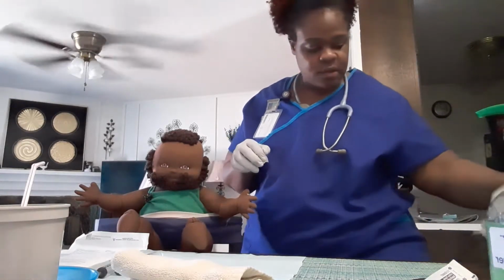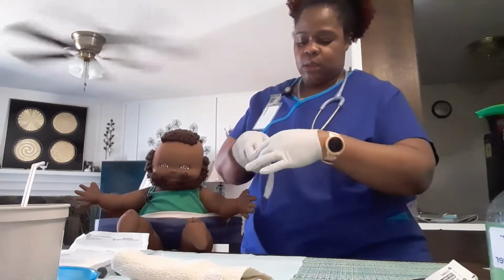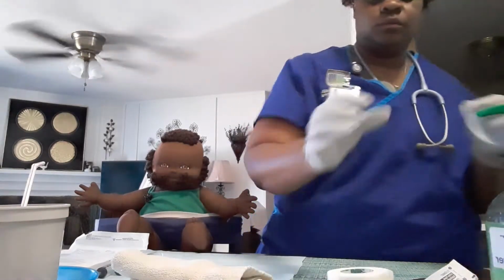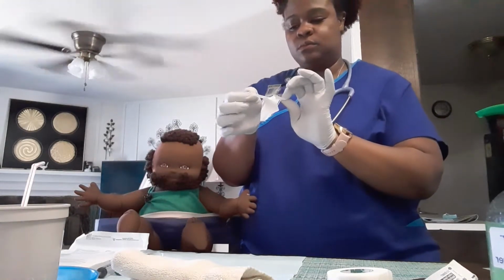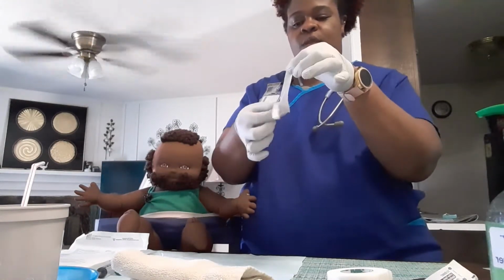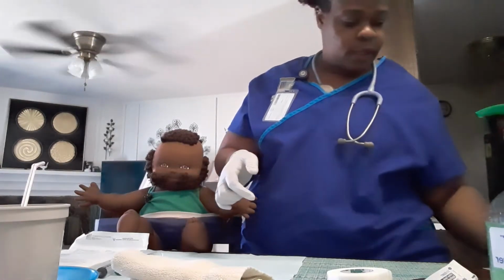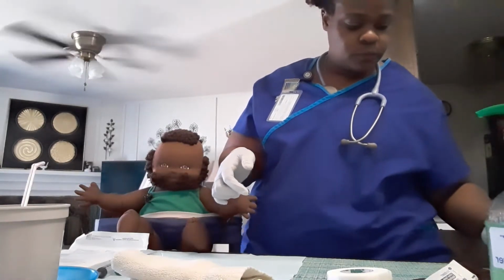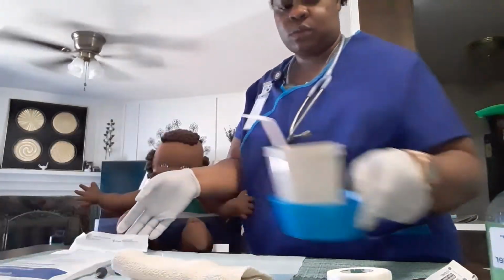Can I stick this to your bedside table? And he said yes. And this is going to be for my anchoring. Just tore that for anchoring. So I have my tape.